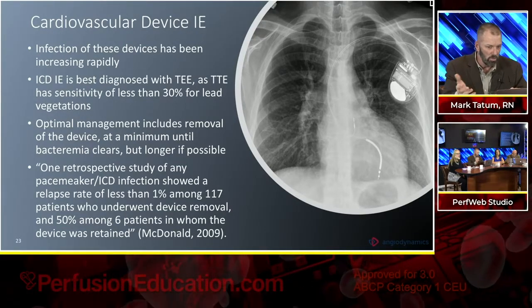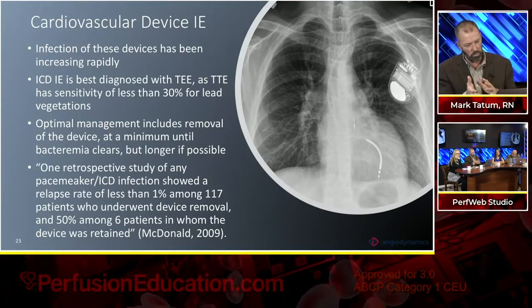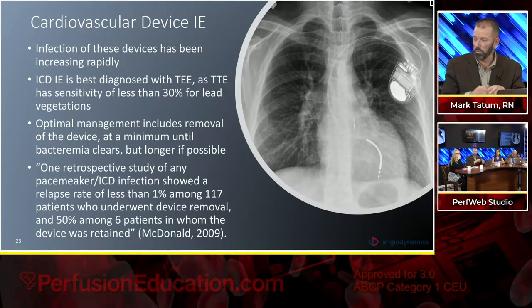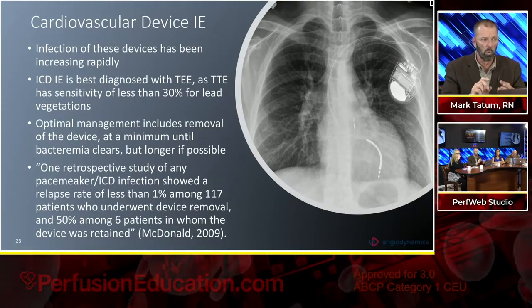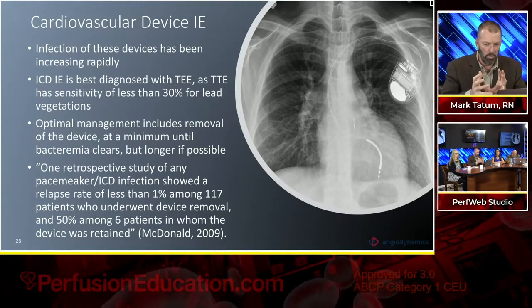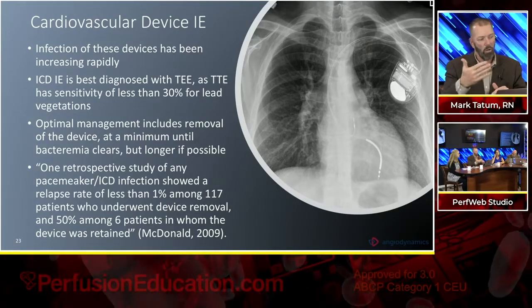When you look at this material, because it's infectious, we talked a little bit earlier in our tricuspid section about embolization of material and the possibility of septic pulmonary emboli or a pulmonary abscess. When you do a pull and pray, the problem is that the issue doesn't show up while they're on the table.